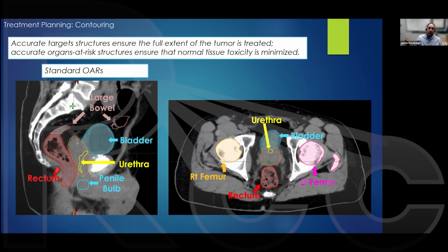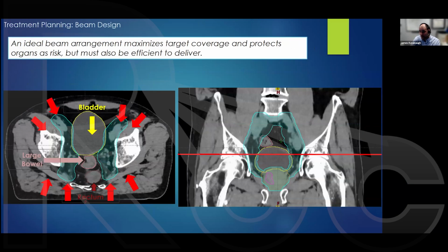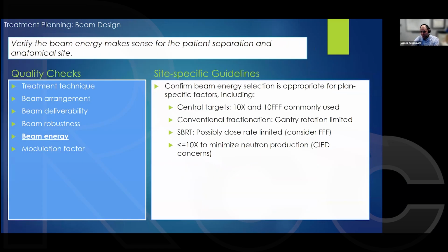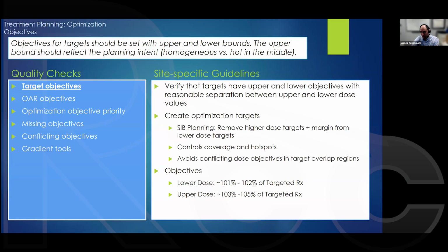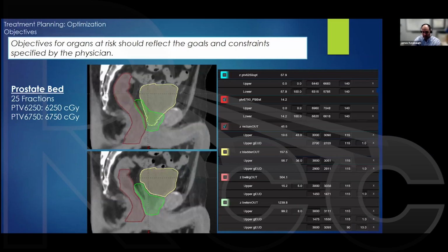Okay, well, now I don't know where the urethra is, but it should be relatively close to where we thought it was going to be. No hot spots in that central region. So that obviously requires a different imaging technique, which everyone may not have access to. And so in the realm of prostate SBRT, visualizing it in some capacity in some of the imaging is helpful. And then building that PRV of urethra plus a little bit of margin gives us some flexibility to ensure we're doing it safely.